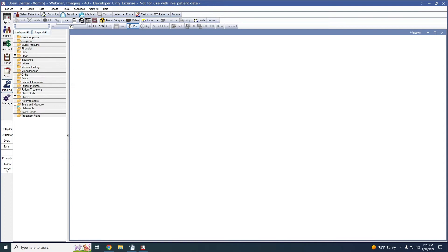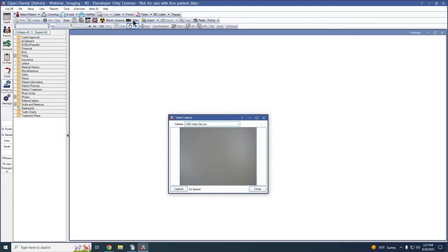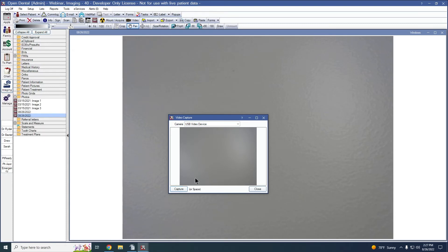Now we'll go over how to capture one or more images using a radiography sensor, intraoral camera, or webcam. Please note an active registration key is required to use the acquire or video buttons within the imaging module. To capture images with an intraoral camera or webcam, click the video button on the imaging module toolbar. On the video capture window, select the intraoral camera or webcam from the camera dropdown menu. You'll see a live feed from the selected camera. Click capture or hit the space bar to capture a still image. If a mount is selected, the image will go into the mount. If a single image is taken, the image will save depending on the imaging preferences. If a default category for video capture is set in the imaging preferences, the image is saved to that default category.